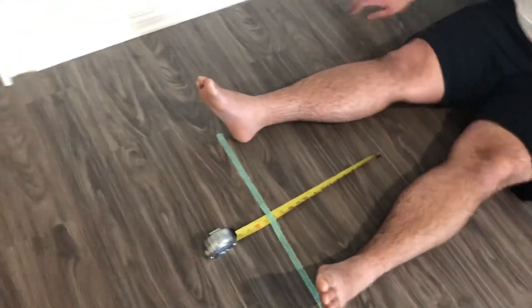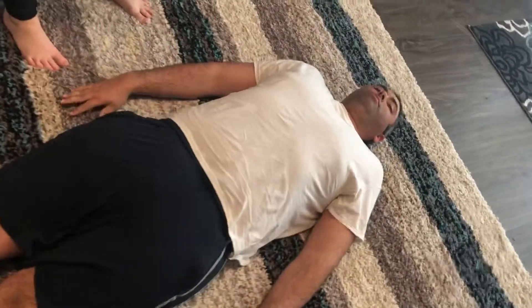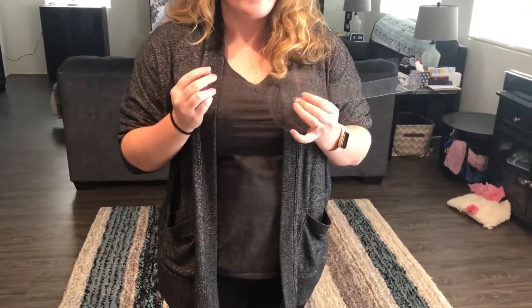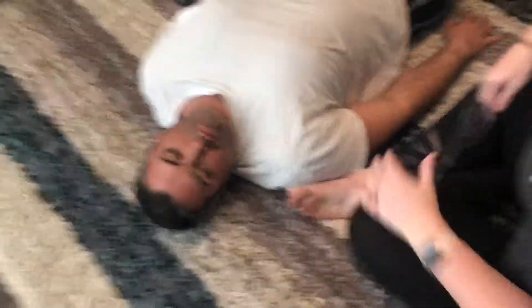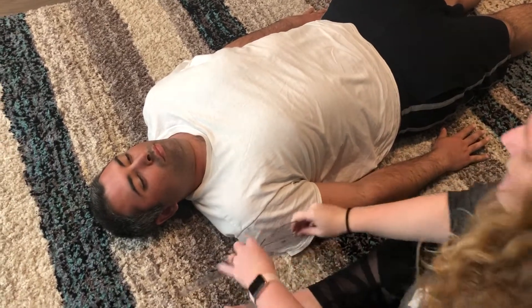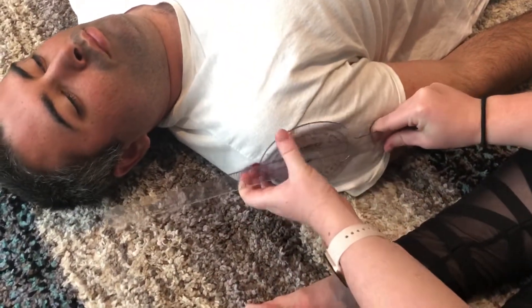I'm gonna have you lay over here on the rug, flat and looking straight up at the ceiling. Now we are going to be measuring his flexibility with this contraption, which is called the goniometer. You want to place the big circle part of the goniometer right at the joint. We're going to be doing his shoulder, elbow, hip, and knee to check for flexibility. Christian, we're gonna go ahead and have you do your shoulder first — I want you to go straight back, and once you start to struggle, stop. I'm gonna place it right at his shoulder joint.